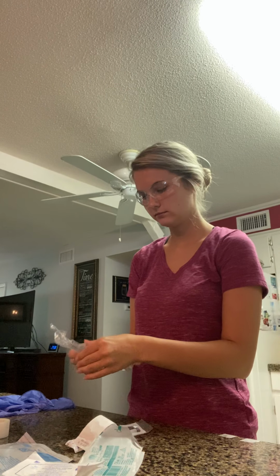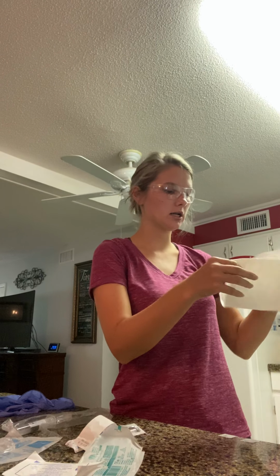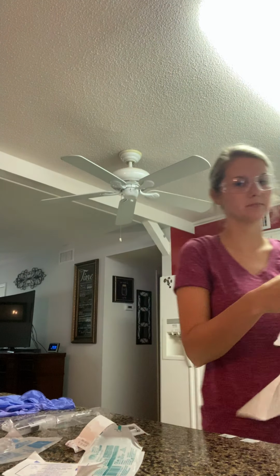The saline. And I will have 2 pieces of tape. And I have a waterproof barrier that I will place underneath the patient's arm.